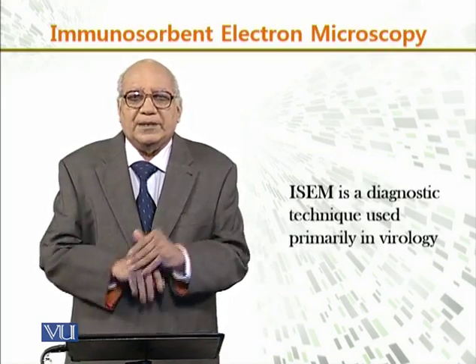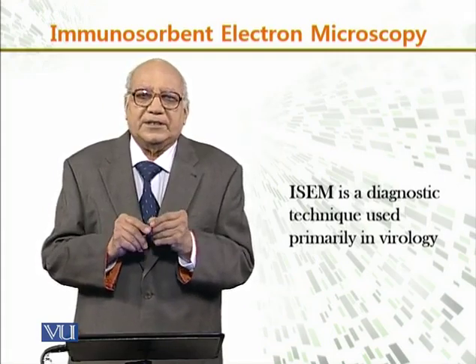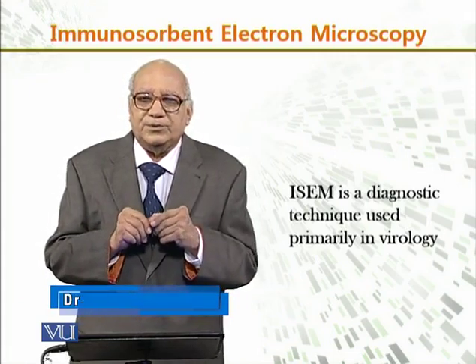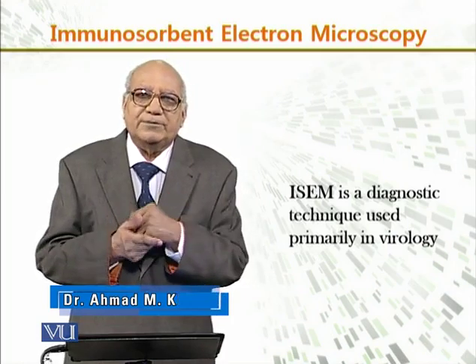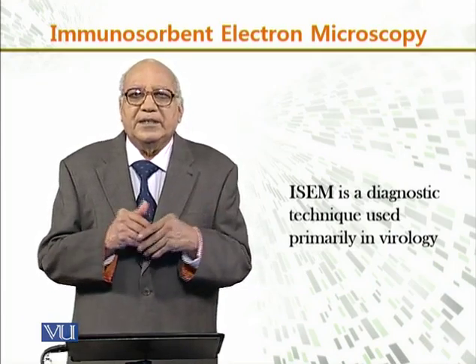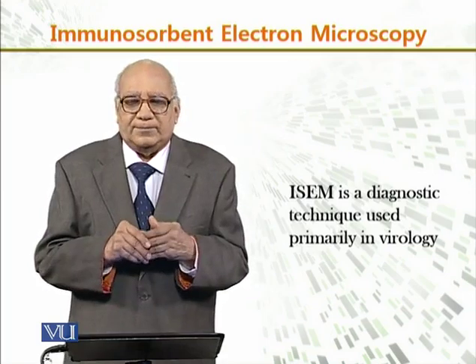Now, immunosorbent electron microscopy is a diagnostic technique used primarily in virology. You see, we have been previously discussing the cells, the whole cell, its behavior, the antigen concentration, and so on.